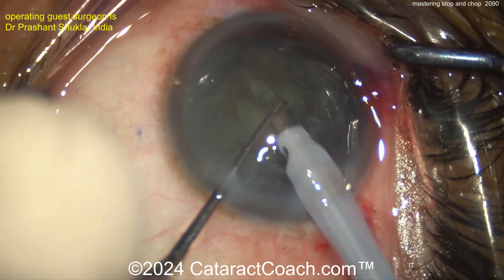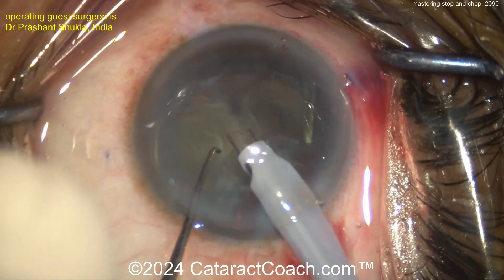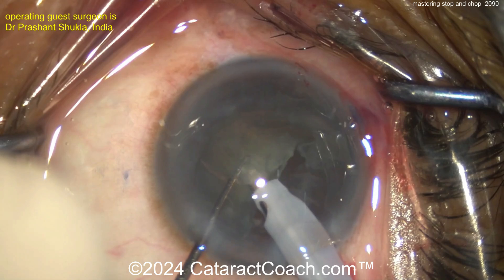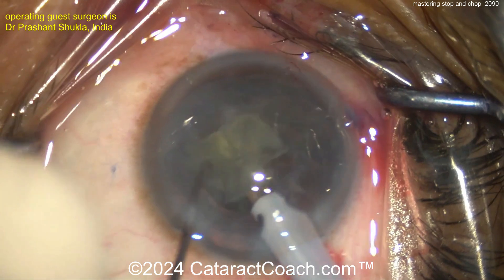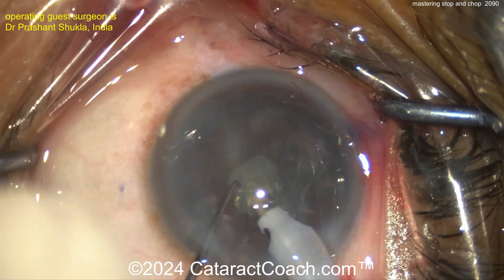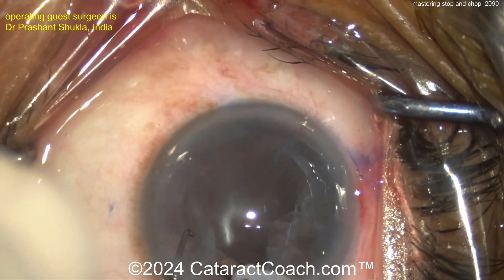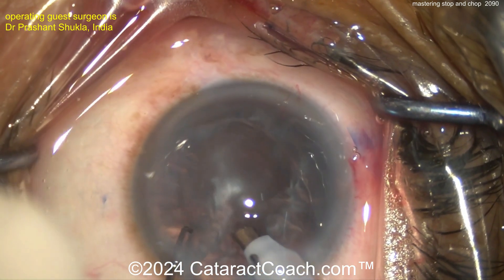This surgeon does a beautiful job of a Stop and Chop technique. It is January — in the northern hemisphere, academic years run from July 1 to June 30, so we're halfway through. In the southern hemisphere, the academic year correlates with the calendar year, so January may be the very beginning. In either case, you need to make sure your skills are up to speed. You need to master Divide and Conquer, Stop and Chop, Tilt and Tumble — we featured all these videos this week — and also Phaco Chop, which we'll get into shortly.